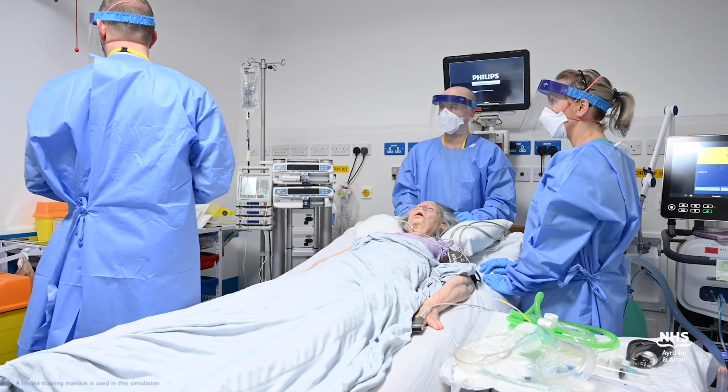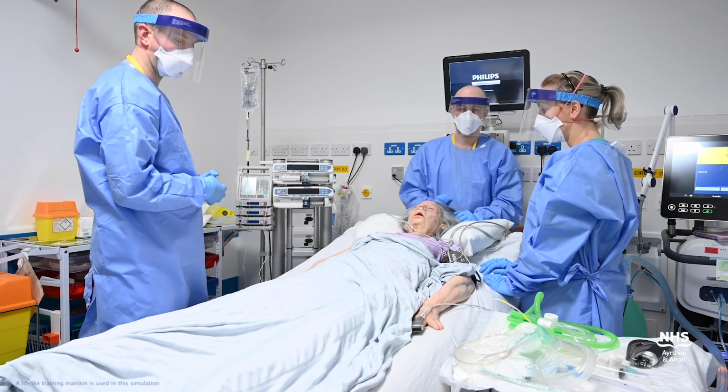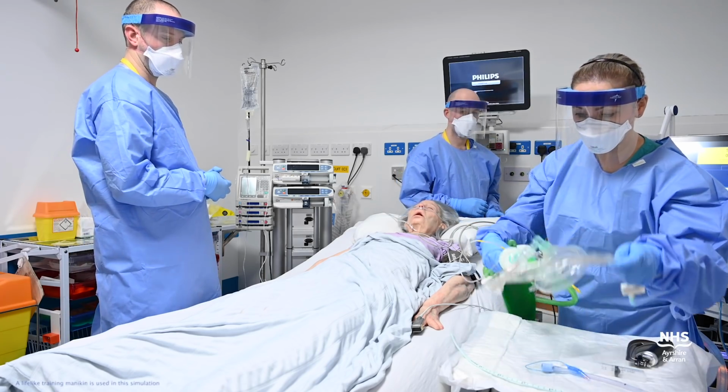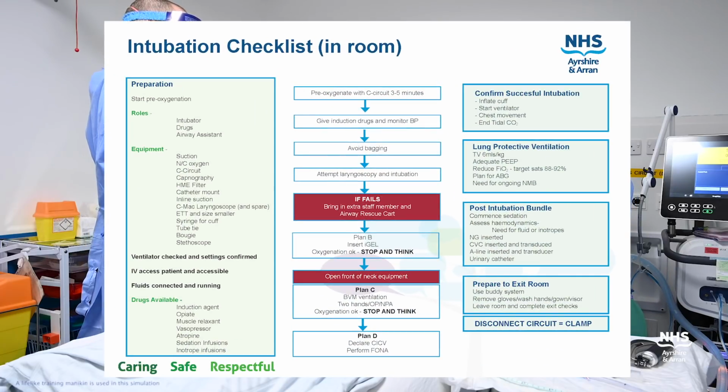So let's start running through our pre-intubation checklist. Okay, so start pre-oxygenation. Let's go. Once in the room, staff adopt the positions that are appropriate to their role, and the intubation checklist is commenced.